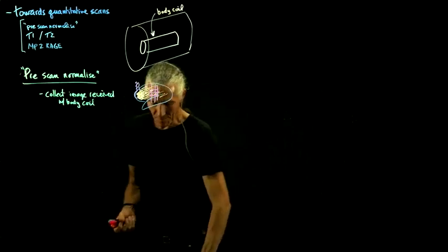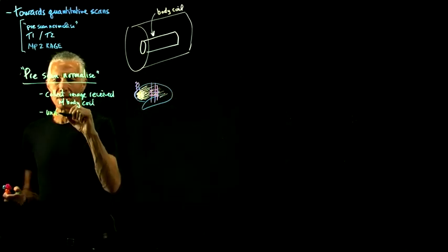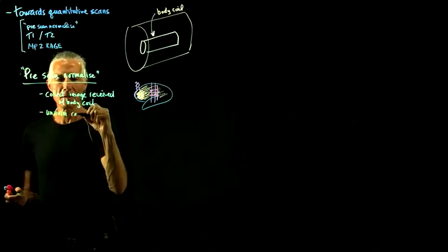And the advantage of this is it's uniform brightness, uniform coil fall-off.